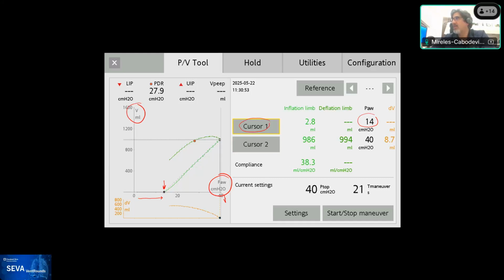We were assessing the patient, trying to figure out what was going on, and it did not become evident until we put the patient on a square waveform. But it was after we had seen the presence of an airway opening on the PV curve that we did that.